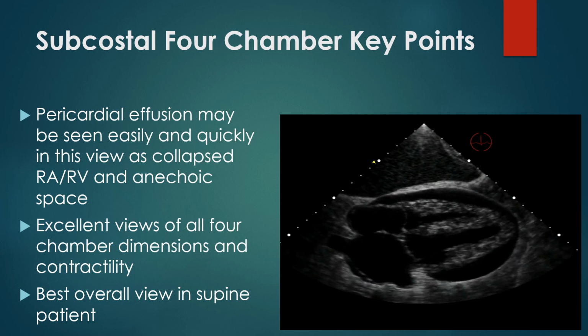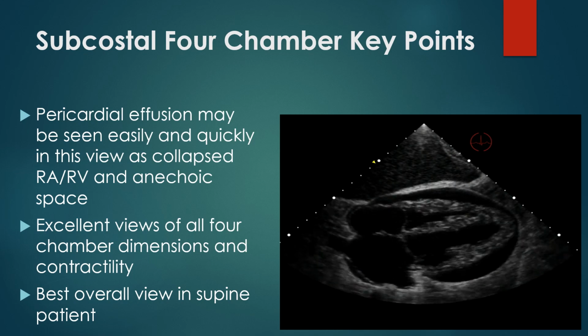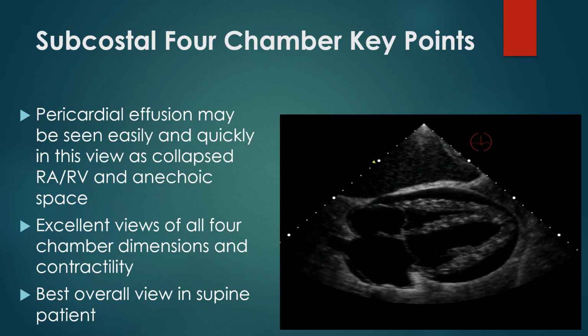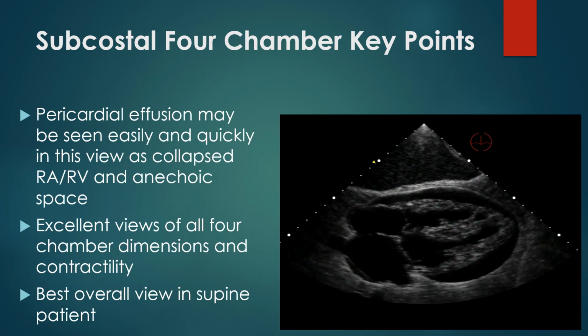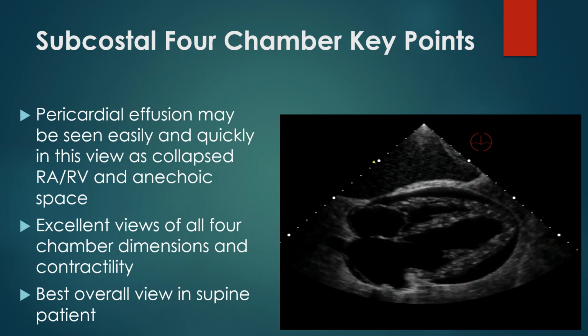This is what they teach the EMS guys, because you can actually get this view when you're doing CPR. So it's a very nice, very down and dirty view of all the chambers. It tells you a lot about whether or not something really bad is going on.